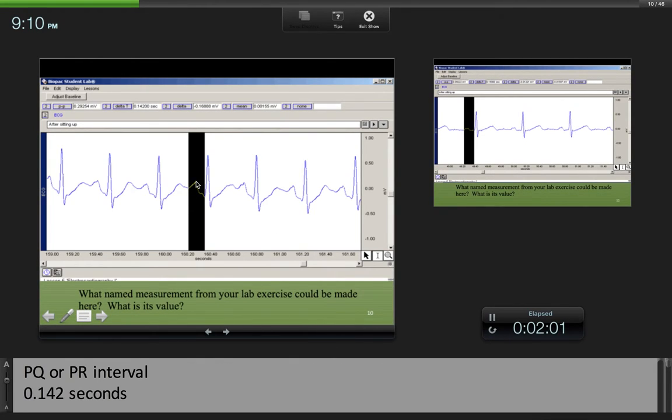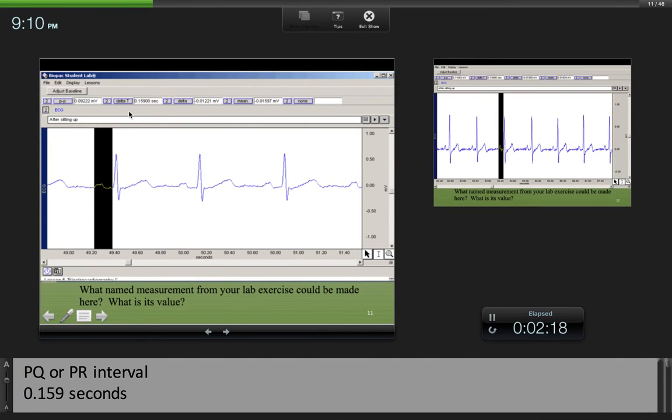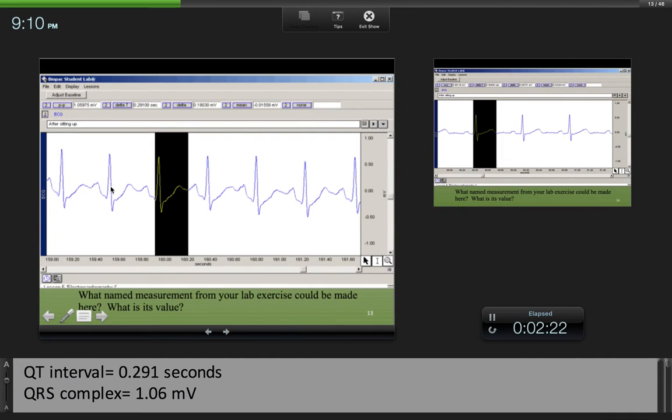Here we have a P wave, we have a PQ segment, and then we also have what looks like a bit of the Q wave. We can call this the PQ interval or the PR interval, and delta T will give us its value. Here we have the same thing, and the same thing again.